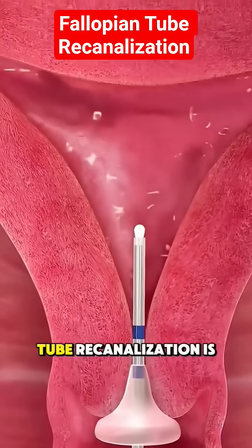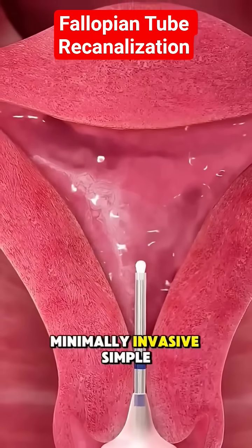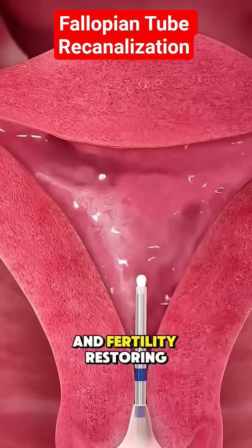And that's how fallopian tube recanalization is performed — minimally invasive, simple, and fertility restoring.